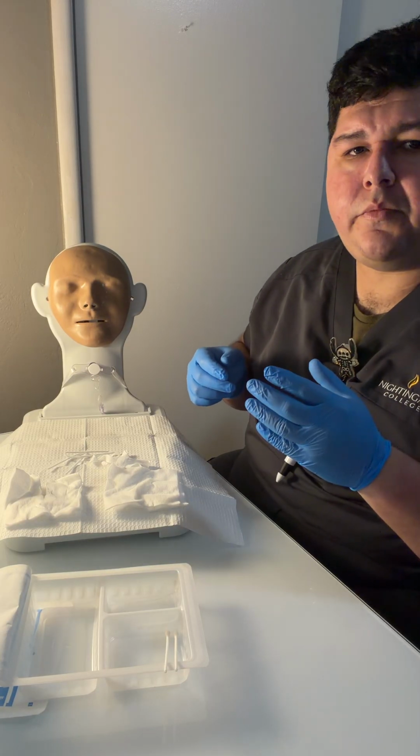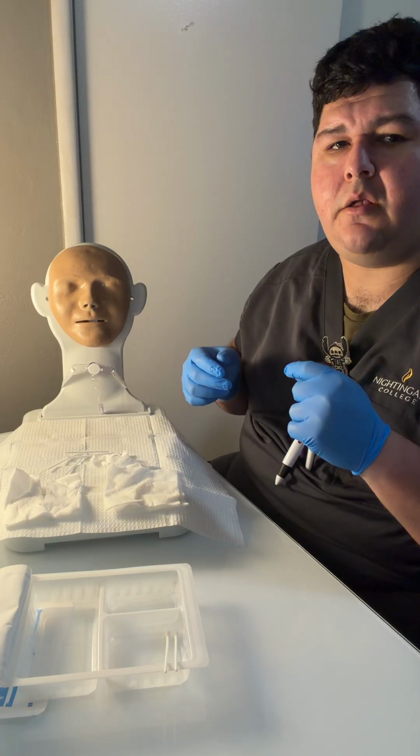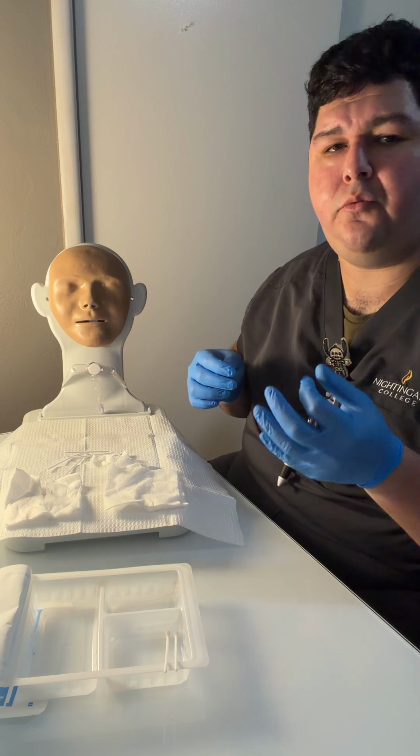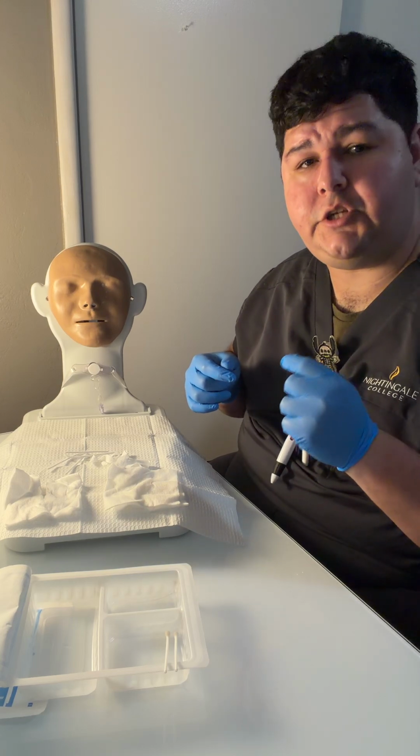At this point, we're going to change our trach ties, and we would ask for 2 people or for assistance for a 2-person task. So at this point, I want to carefully change the tie.